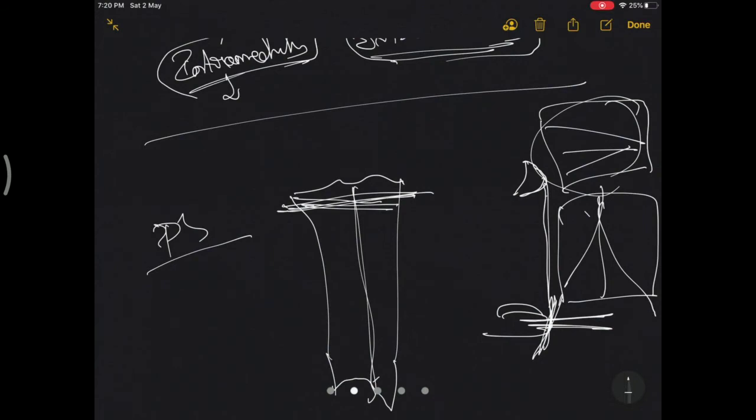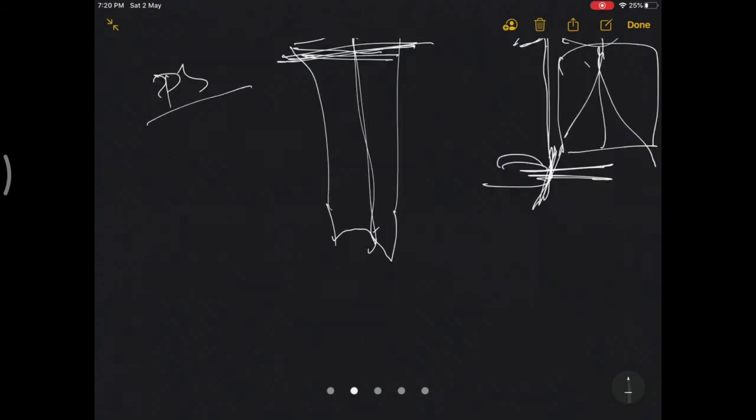Okay, so likewise you will adjust the slope and the varus valgus, and you will take a proximal tibial cut. The steps which I am explaining assume that you have a patient with bicompartmental osteoarthritis, and the deformity seems to be correctable after anesthesia, or once you take out all the osteophytes and release some amount of the deep MCL and other things.